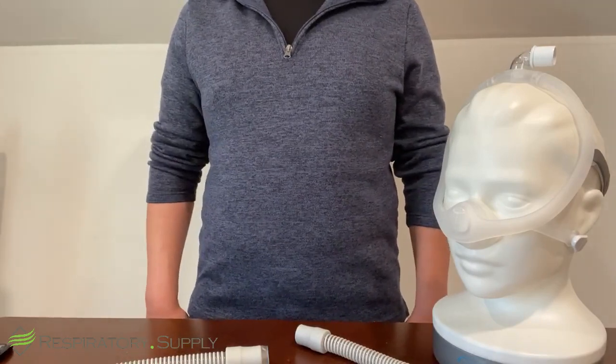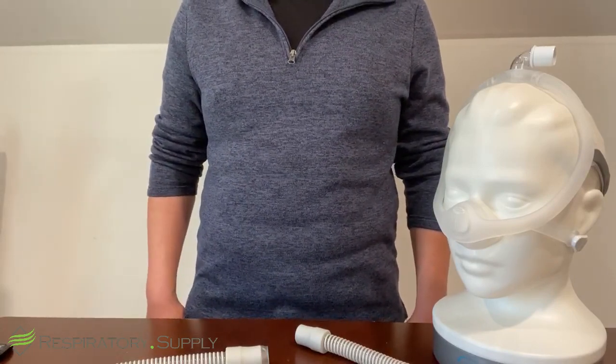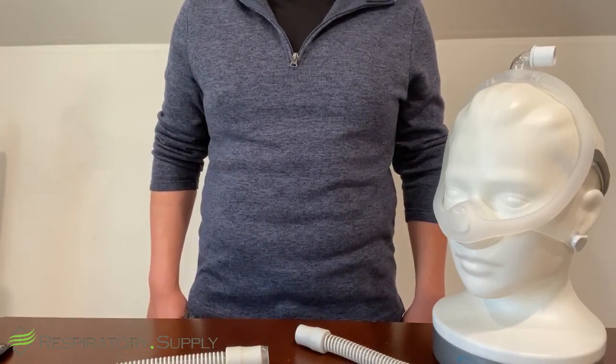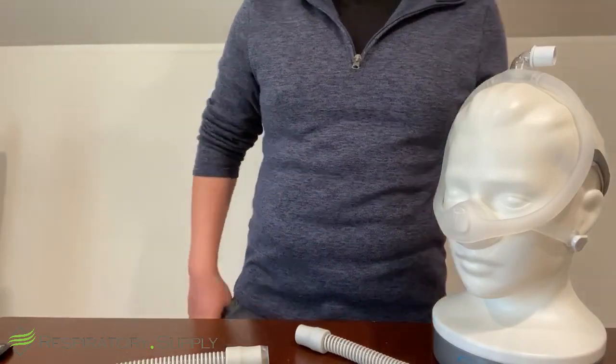But throughout the course of this video, I'm going to show you two examples of previous connectors left in the end of tubing, and then how to remove them so we can get your new mask attached. The two masks that we're going to be talking about today are the Vitara and the DreamWisp to my left here. So let's start with the Vitara connection piece and we'll get a closer look.